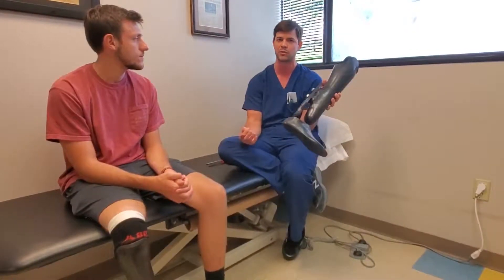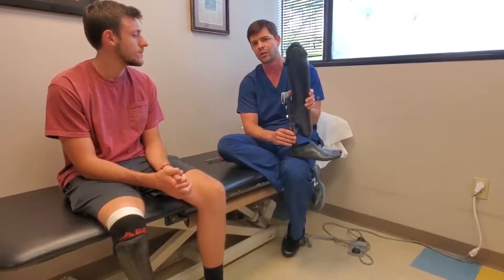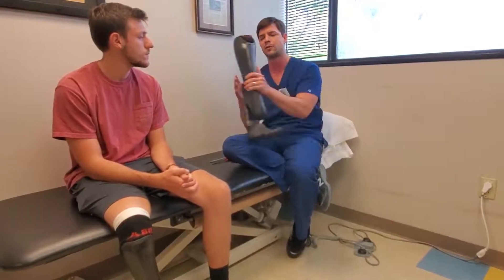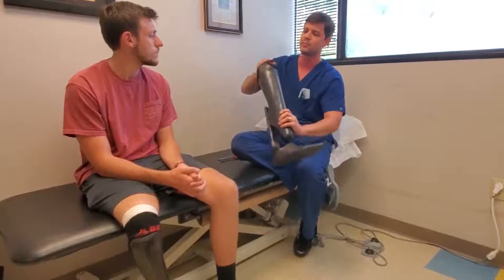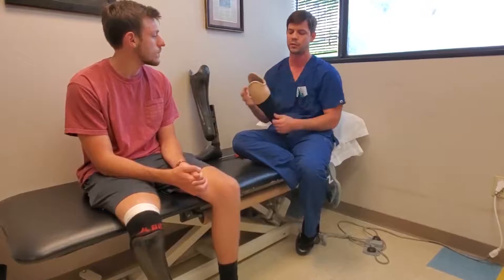There's a lot of tape on here now because he's very active — he's a competitive sprinter, even at the junior Paralympic level. This is his walking foot; he also has a running blade. He came to us this past week because he's been growing, having some fit issues, and also a broken foot.